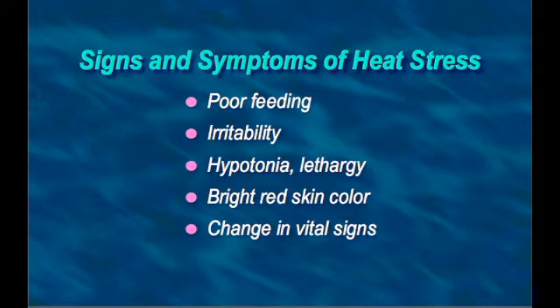So again, temperature, both core and skin, is one of the vital signs of the baby and should be considered. Mistakes can be made, the baby can change. All this has to be a daily consideration, and it is one of the reasons why babies need to be closely monitored in an intensive care unit when they're in an incubator or in a warmer or preterm and at risk for heat abnormalities.